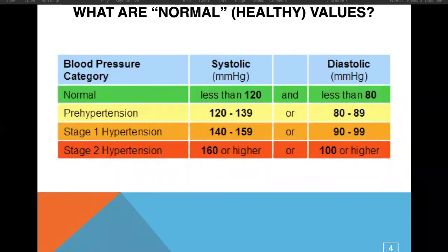And again, these blood pressure values are resting blood pressure. In the field, in EMS, we often see systolic blood pressures that are above 120, because people also have a higher systolic blood pressure when they are stressed out or in pain, which many of our patients are. So these values refer to resting blood pressure.